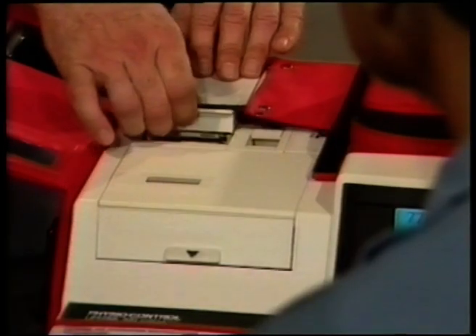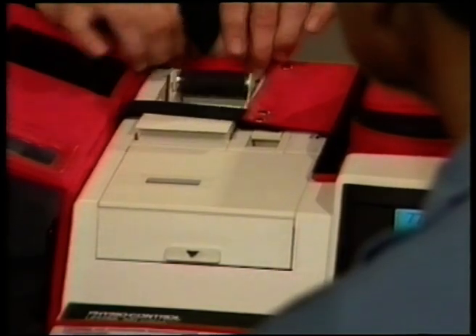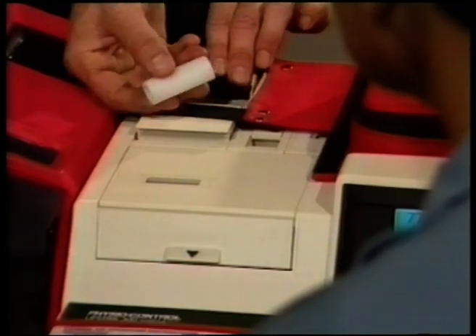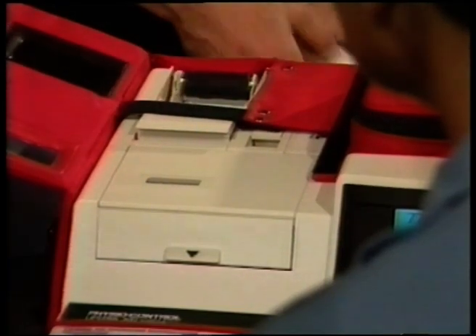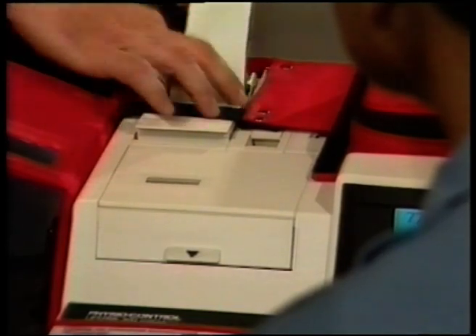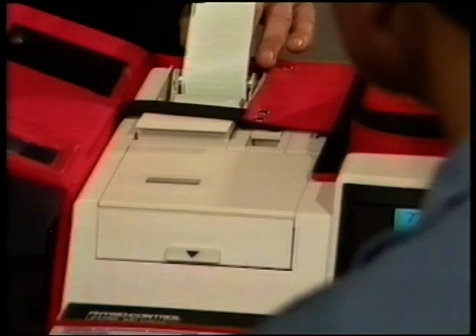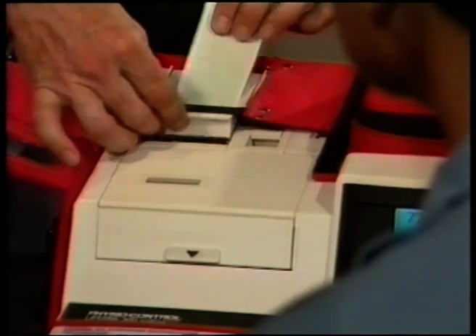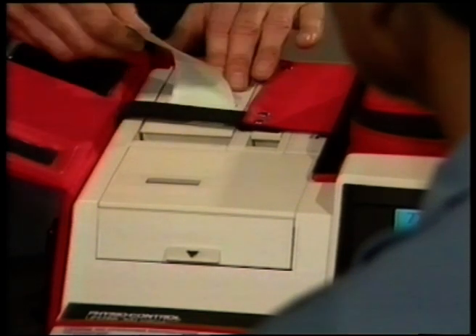To load the paper, pull upward on the front of the recorder case to open it. Push the back portion down into the case. Remove the empty paper spool and insert a new roll with the paper grid side up. Pull out a short length of paper and close the recorder case by pulling the back of the case up and in and pushing the front of the case back.